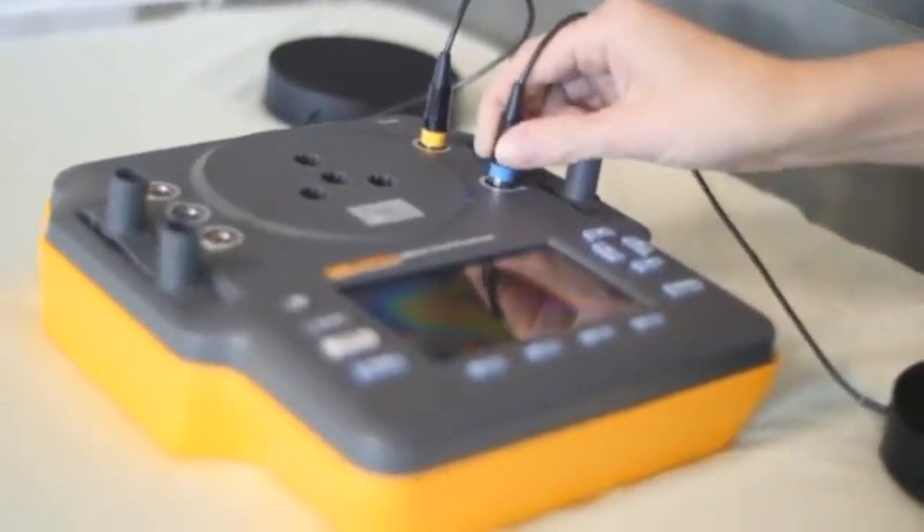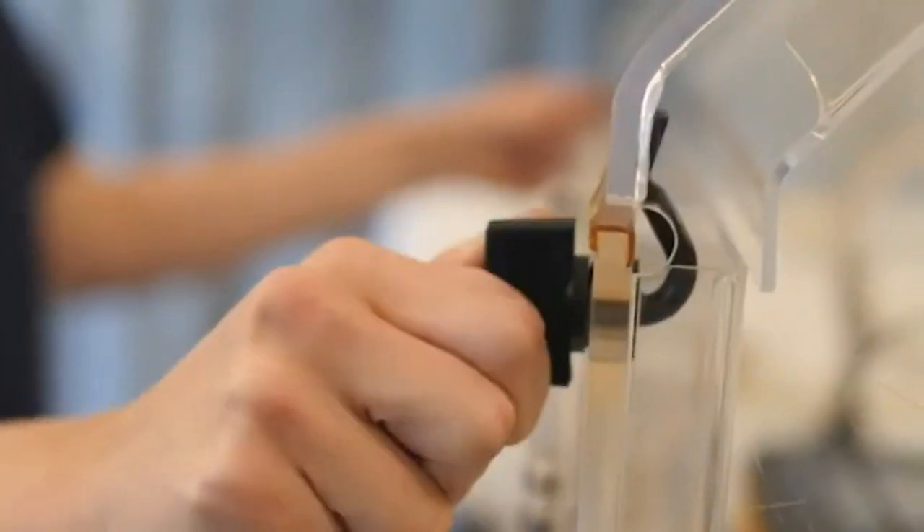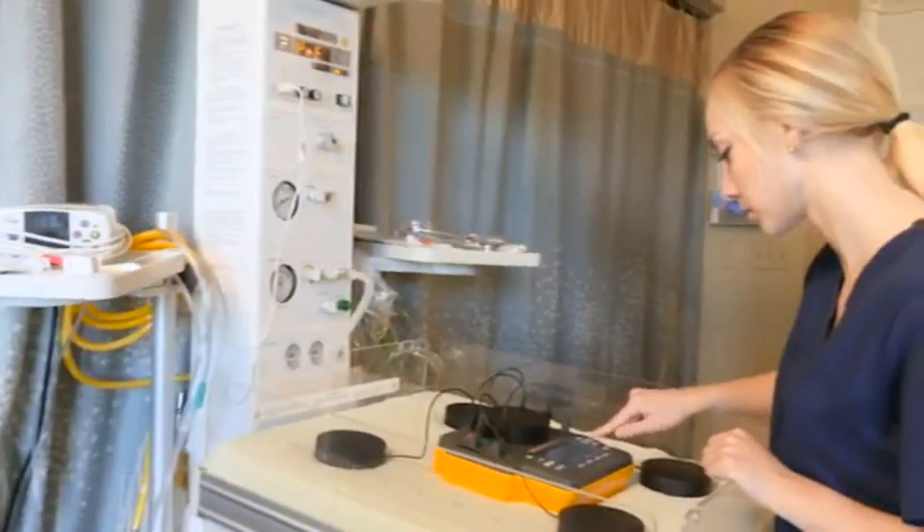Its color-coded probes make it easy to switch between sensors for testing temperature in an incubator or the five pucks for verifying the environment of a radiant warmer.